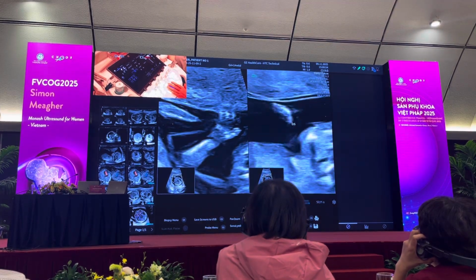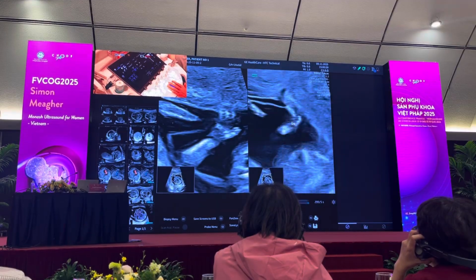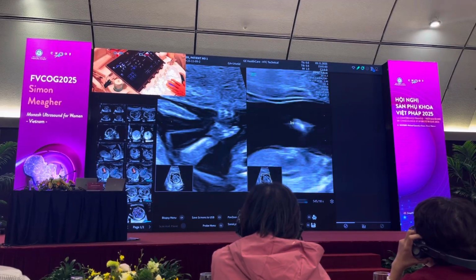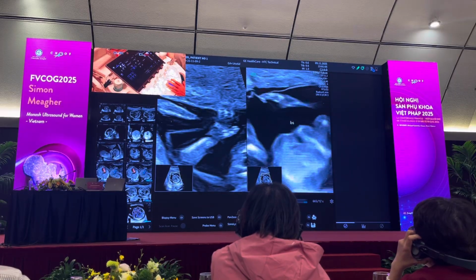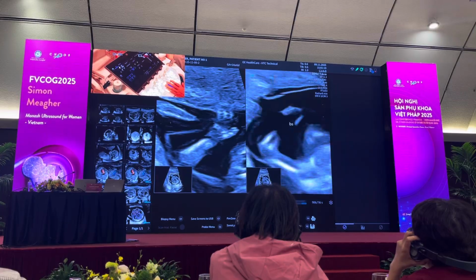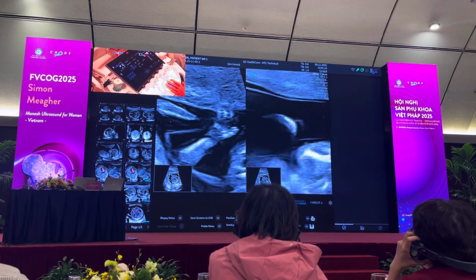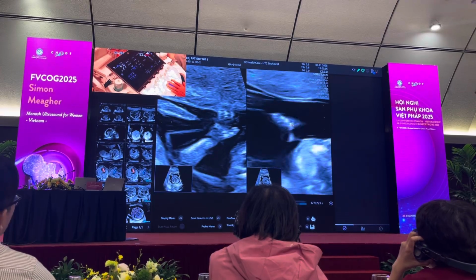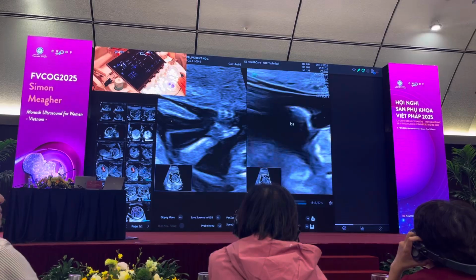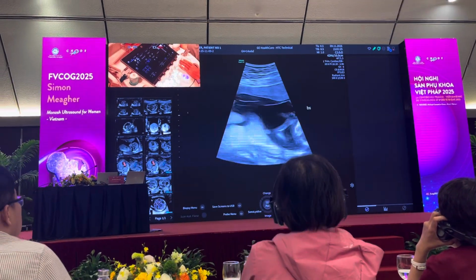Then you update over to go to the opposite side. As you look at the opposite side, you see the finger, thumb, 5 fingers, and if you want to then jump in the same image, make sure that you're examining a separate arm. And you see there, you can see the humerus, radius on that, and then come on straight. You see that there's a thumb, and then come across that there are 4 fingers in this baby's hand. So it's important in a sense when doing a scan that you don't end up examining the same hand twice. And by splitting the image, it stops you doing that.